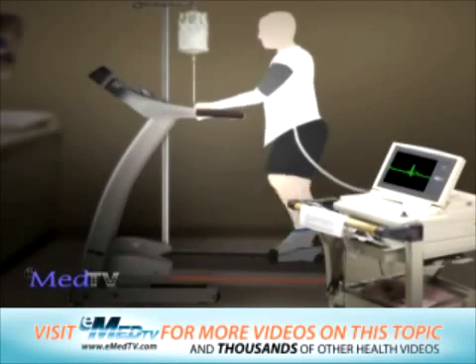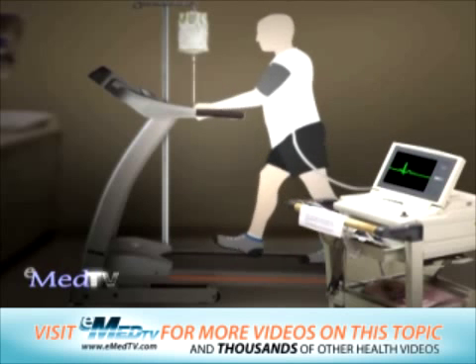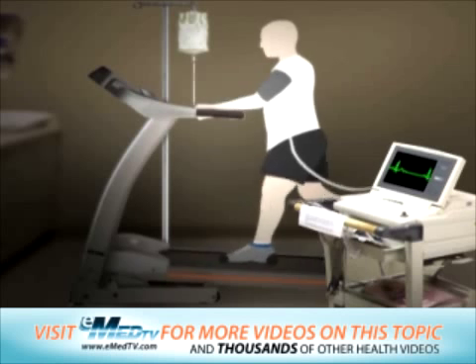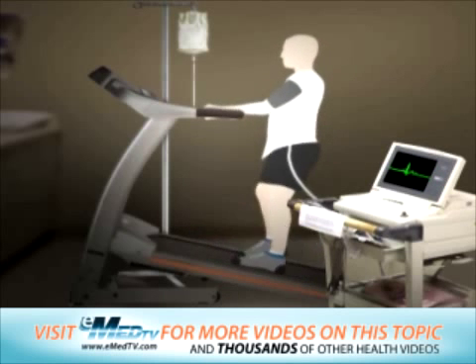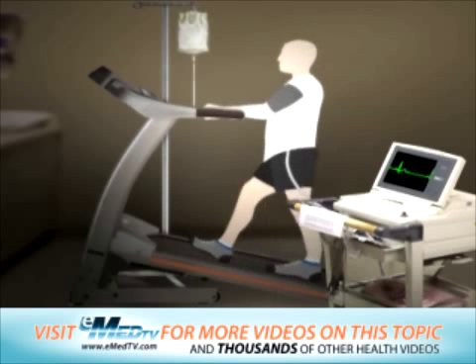You will begin your stress test by walking on a treadmill or pedaling a stationary bicycle. Every two to three minutes, the speed or incline of the treadmill will gradually be increased. If you are out of shape or at a high risk for coronary artery disease, these increases will be smaller and more gradual.